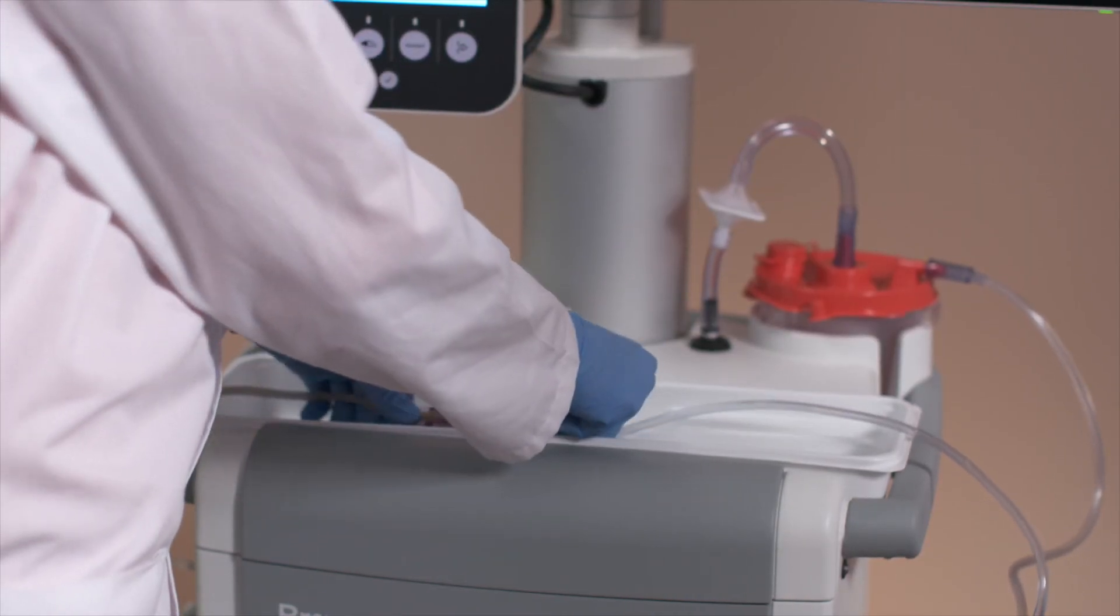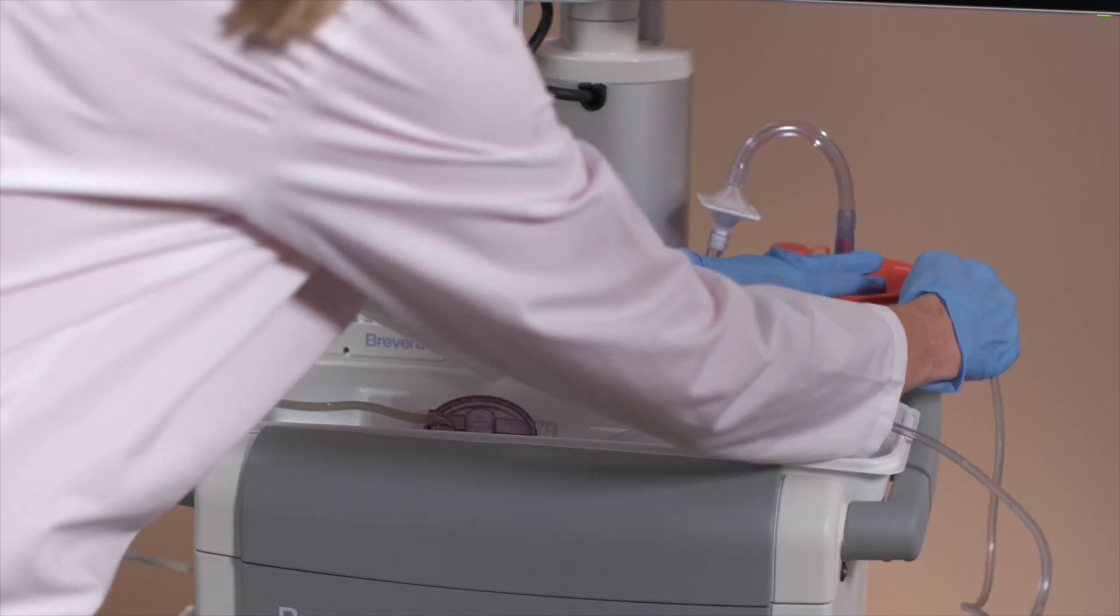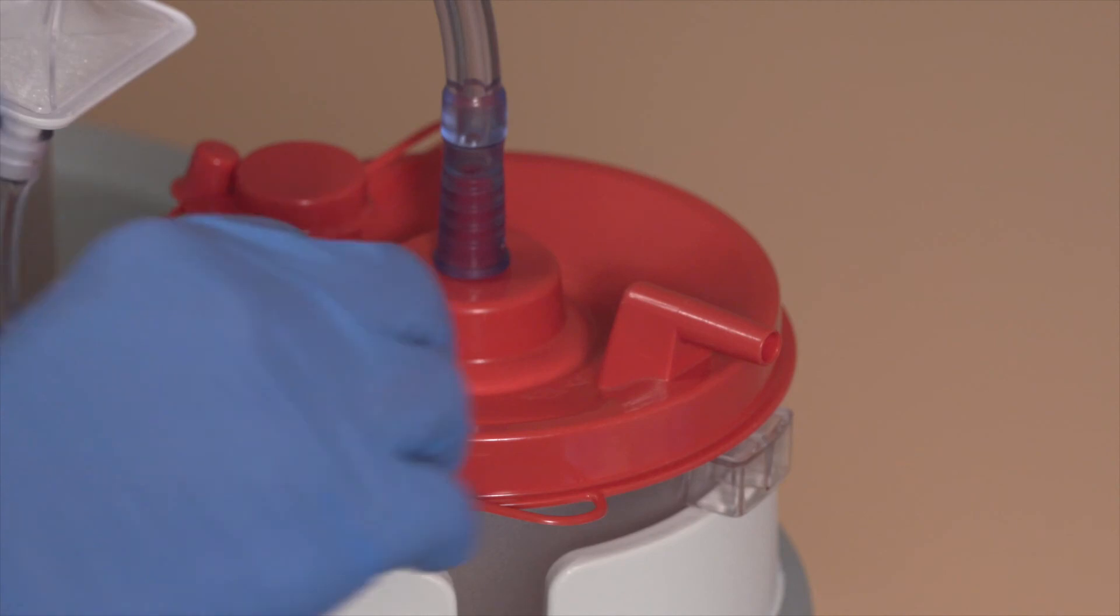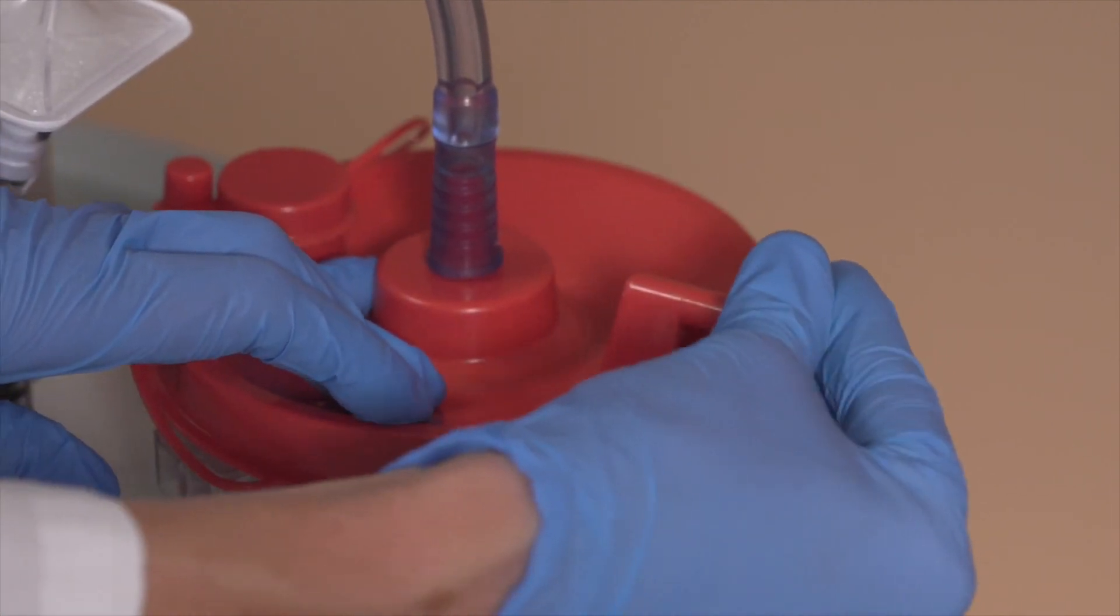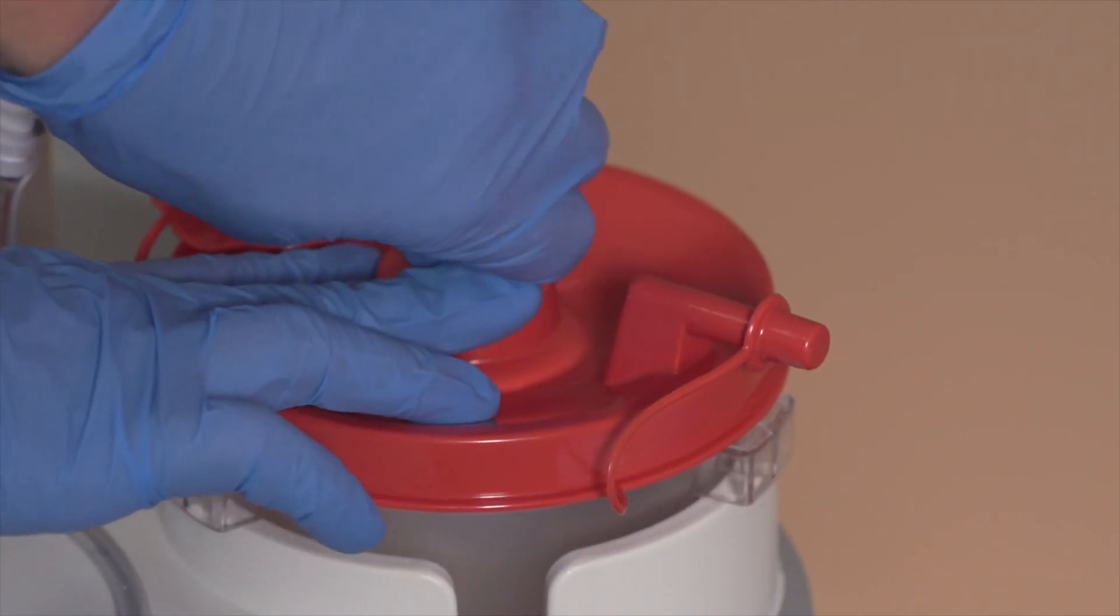The technologist will remove the vacuum tubing from the canister lid and disconnect the vacuum line assembly from the canister lid, making sure to seal all ports.